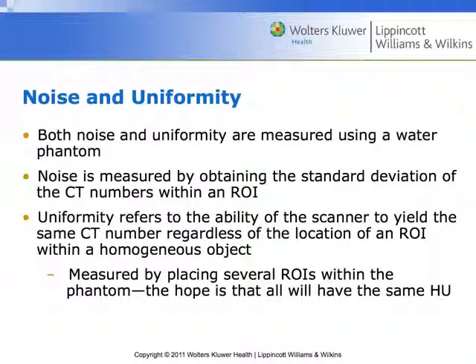There are typically different kinds of design features made specific for that vendor, for that manufacturer, for measuring that. Noise and uniformity are measured using a water phantom, and typically we're going to have some kind of standard deviation numbers. We're going to throw an ROI on that, and we want to be within a certain range.